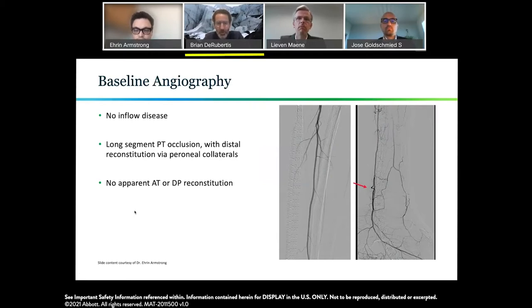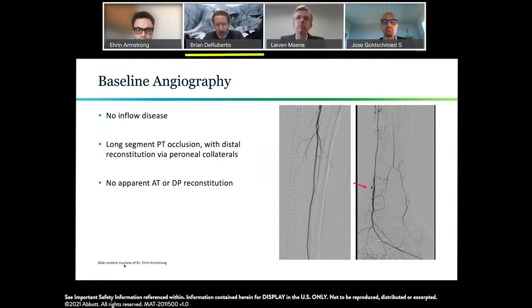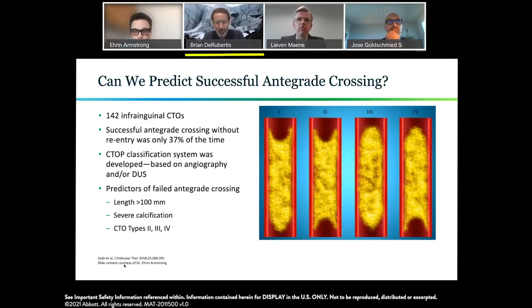This could be a difficult one to recanalize from an antegrade approach because there's not much of a stump of the PT visible. You might be able to probe and find one, but an antegrade approach would be difficult. To find the PT origin, angiography in three orthogonal projections would help, but if it remains hard to find, a retrograde approach would be the first step. Within the absence of a stump, you have to think about how likely it is that you will need retrograde access.